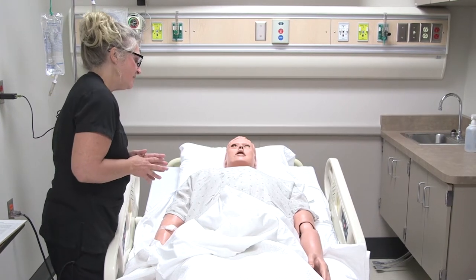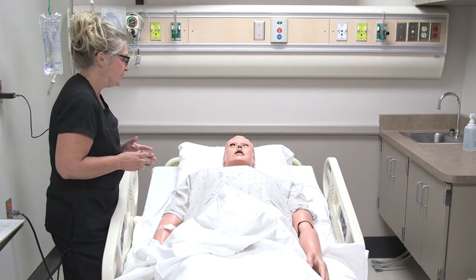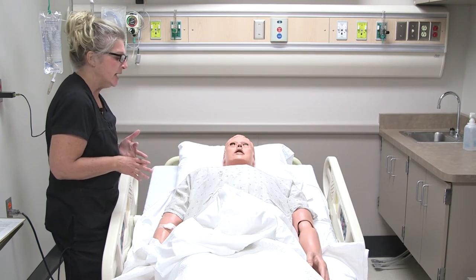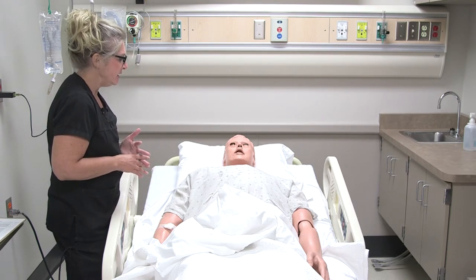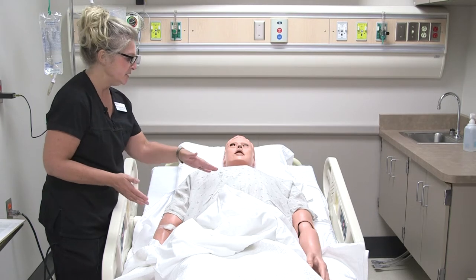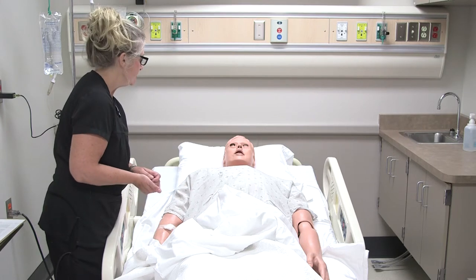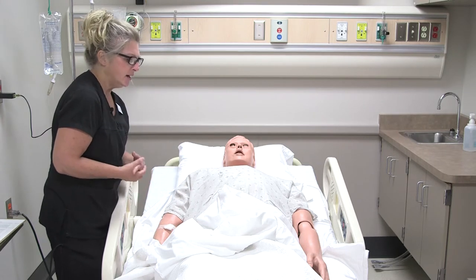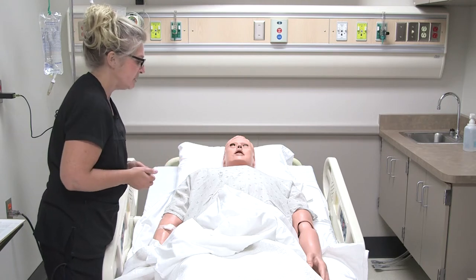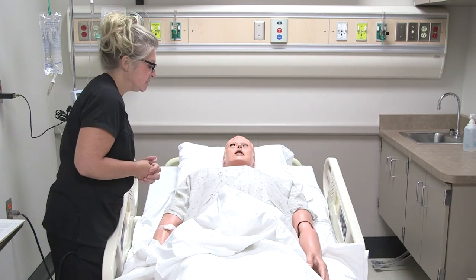So there's a few questions I have to ask you before I begin. First of all, do you have any allergies to like shellfish or iodine? No. Okay, good. The other thing is, have you had any hip surgeries that would interfere with me manipulating and moving your legs? No. Good. How about knee surgeries? No. Okay, good. Because we do have to position your legs, we have to bend them, so we want to make sure you're able to do that. And if I need, I can get someone to help us.